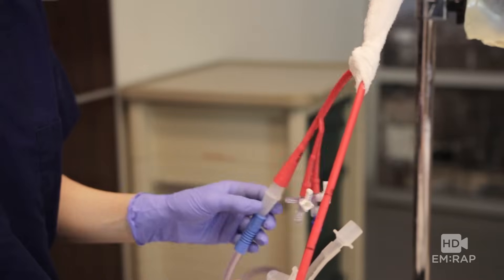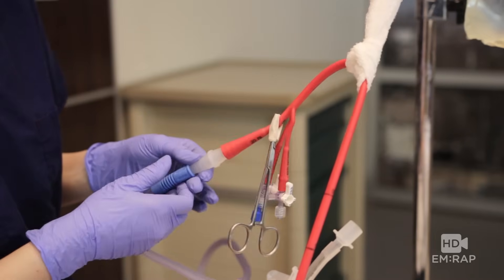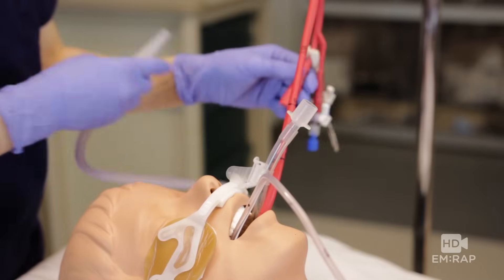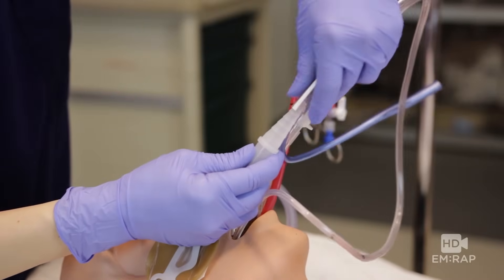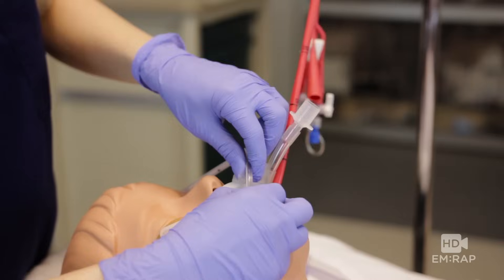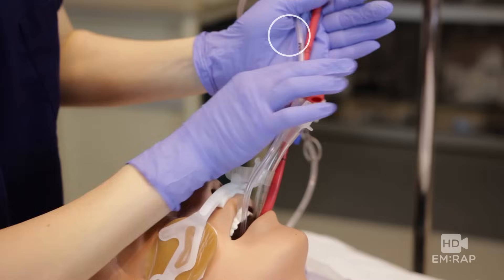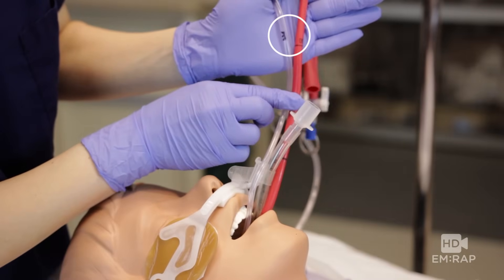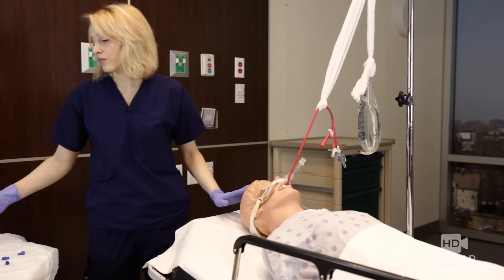Clamp the gastric suction port and move the suction tube from the gastric aspiration port to the OG tube. We're going to check to see if we have residual bleeding in the esophagus. If there's still lots of blood, that means we need to inflate the esophagus balloon. Pull the OG back until the E lines up with the 50 — now the tip of the OG tube is just above where the esophageal balloon will be.